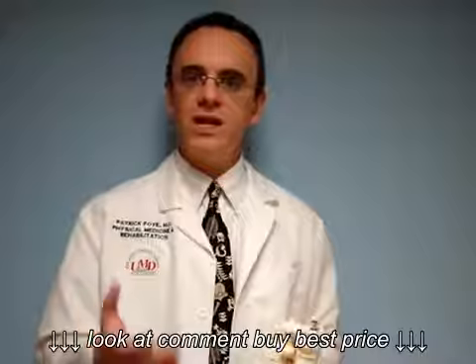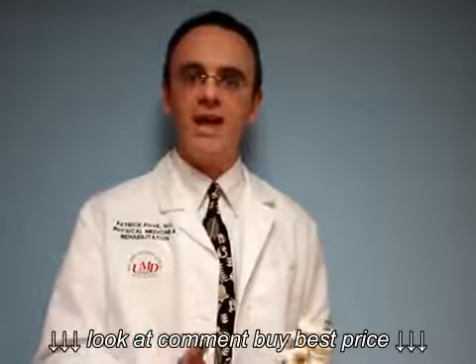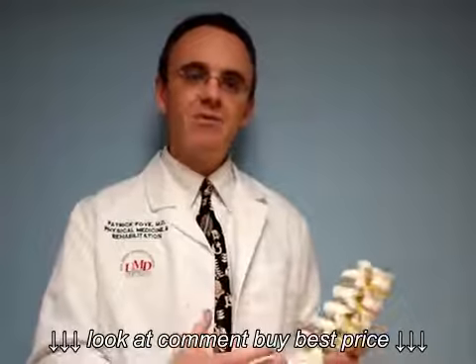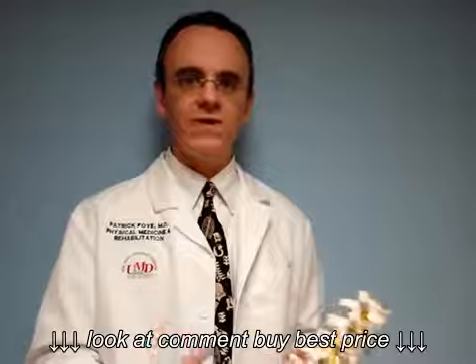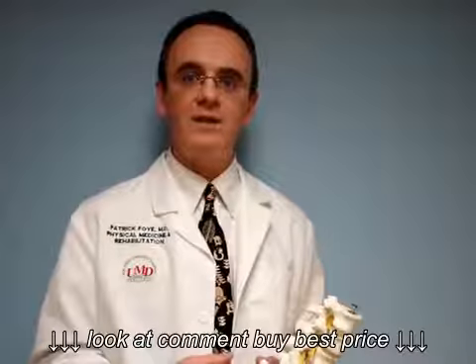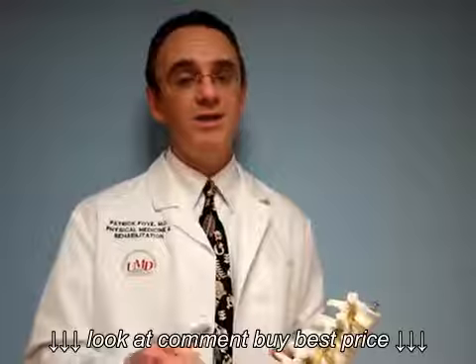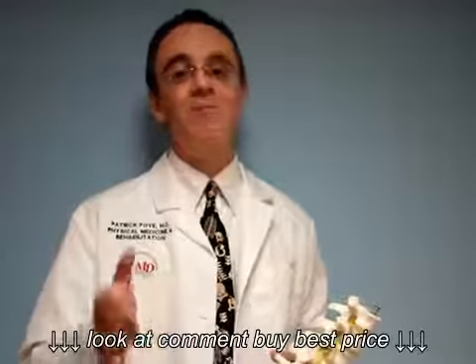After you've had the x-rays done, one of the things that you can do is to get a copy of the official radiology report. What did the radiologist say when he or she read the actual films? Did the radiologist actually even mention the coccyx? Get a copy of the report from your doctor's office, have them photocopy it and send it to you, or give you a copy when you're there for your follow-up visit, and read it carefully. If they do not even mention the coccyx or tailbone within the report, there's a decent chance that they didn't mention it because it wasn't included in the first place.